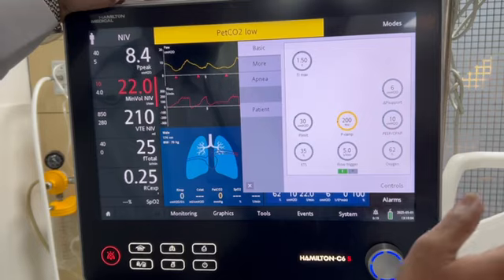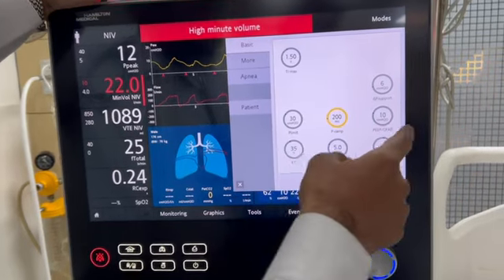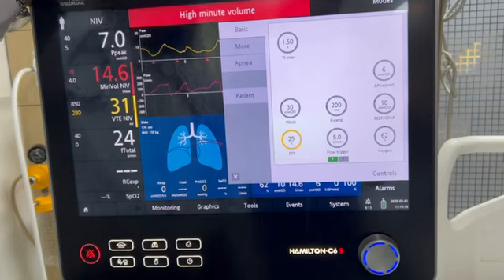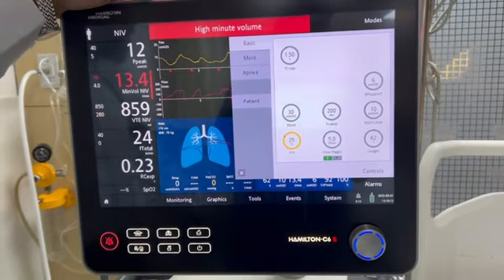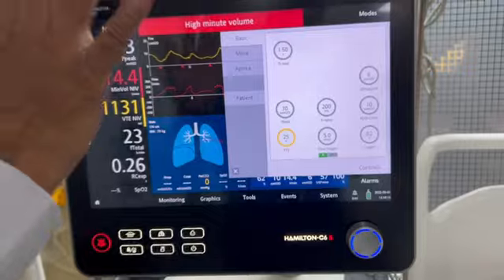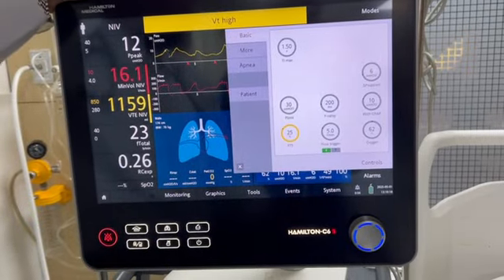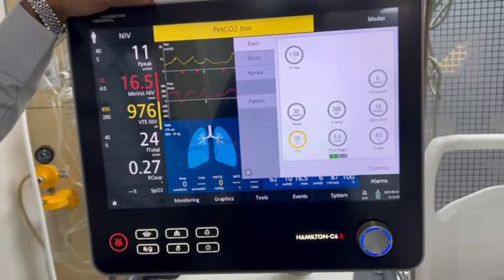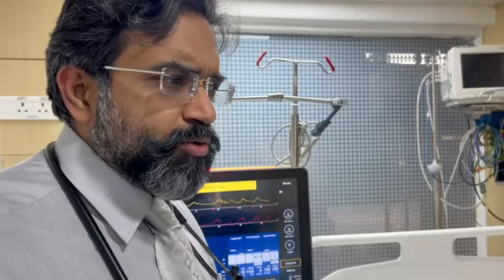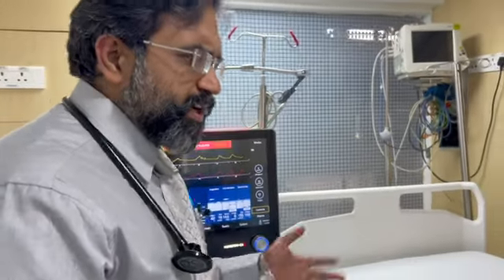And as I told you, the PEEP has to be at 10, and the expiratory time sensitivity, the ETS, it is always better to keep it at 25% and go from there. As it goes further, we can see what to do, but you start the ETS at 25%. So these would be the starting settings when it comes to using the invasive ventilator.